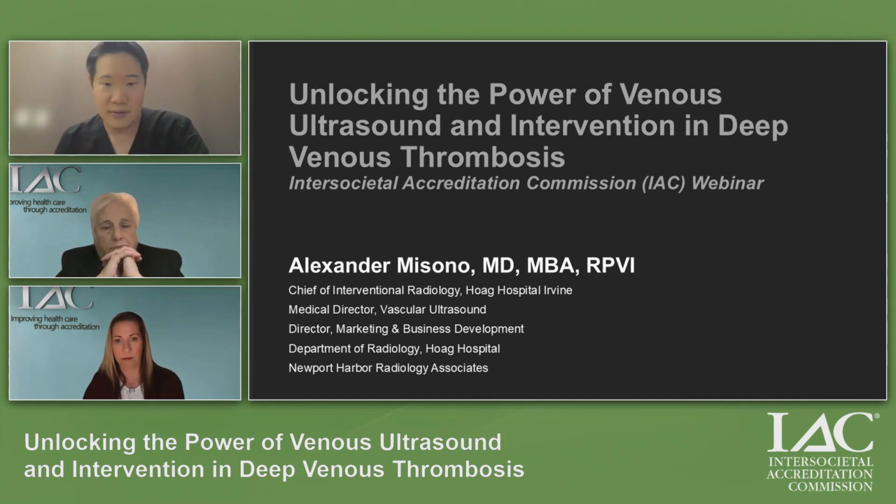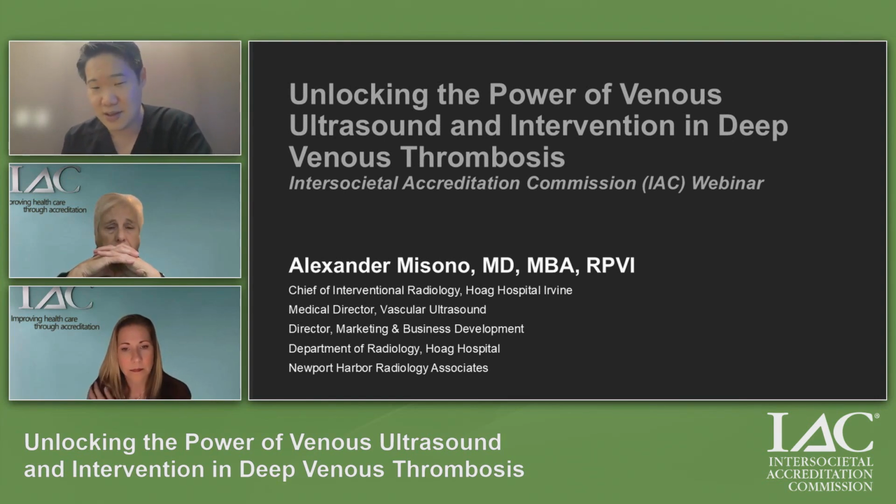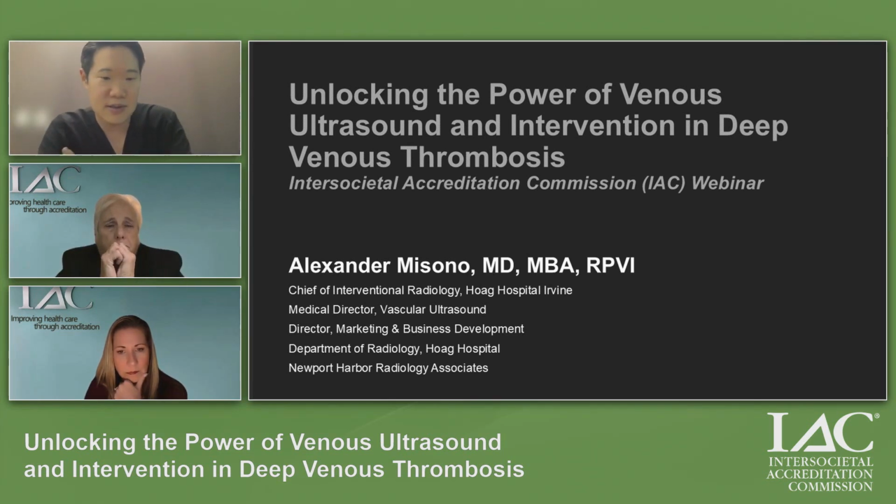We've gotten so much better, especially you all on the call, right? The sonography has gotten so much better in the ability to identify and characterize calf vein DVT. I remember training in an era where we had a lot of trouble even seeing, and I think part of it is just technique, part of it's technology, the crystals are better, whatever, right? It's a better way to look. But that leaves us in a bit of a quandary where we are now able to diagnose a lot of calf vein DVT, and there is a question as to the clinical importance of that. Even for the first question, I answered with that, right? What is the clinical manifestation of that for that patient, and what are the clinical implications for basically the safety or the danger of having that thrombus in that patient?